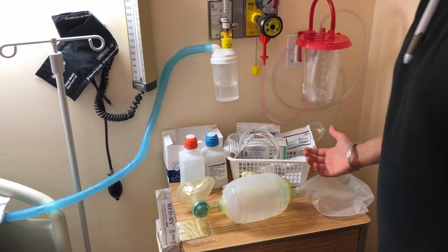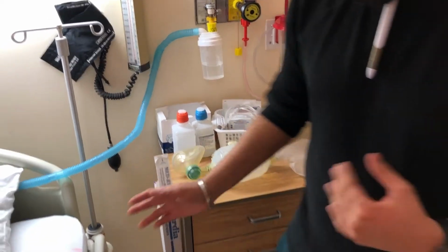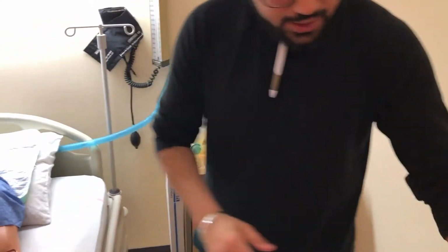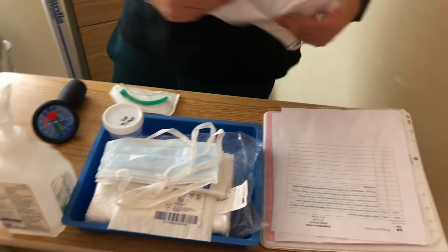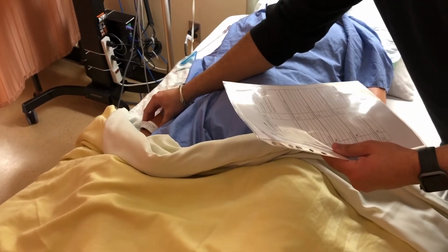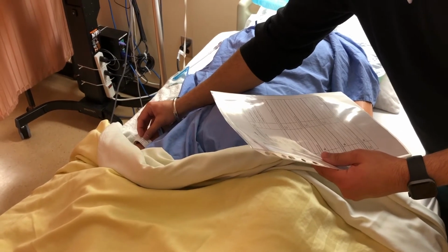And just extra equipment just in case there's an emergency that arises. So everything seems to be working, and we're going to start with our procedure. So we could do a patient check. We already know it's the correct patient, but I could just look over the band right here, look at our mark, compare the name. Fred Fredrickson, MRN is 0990127.